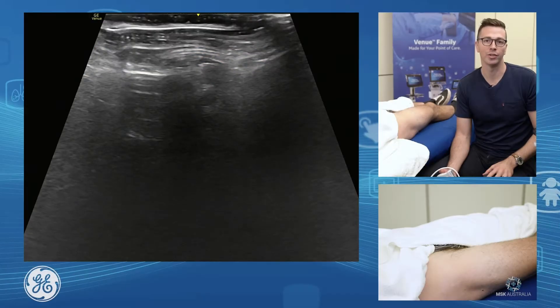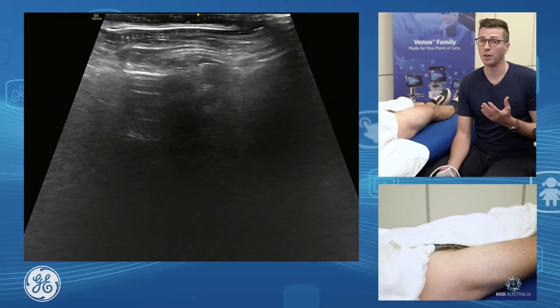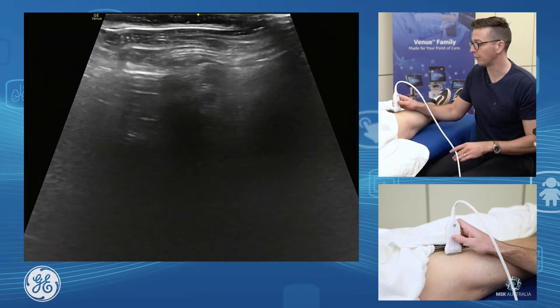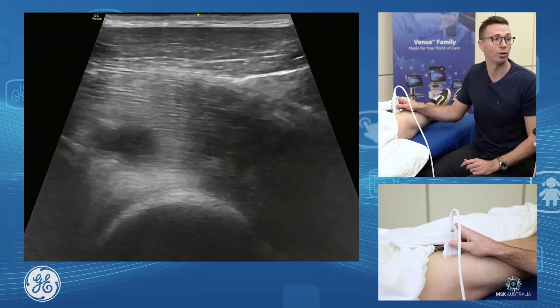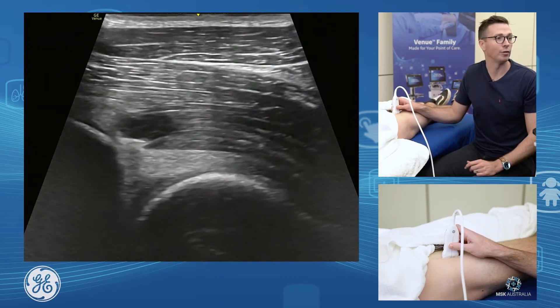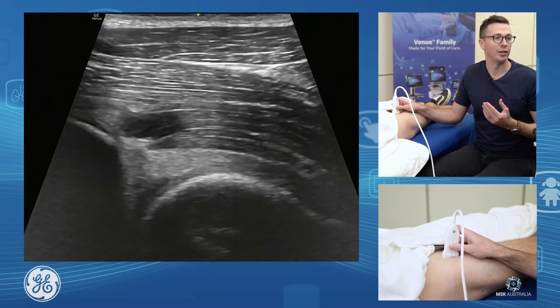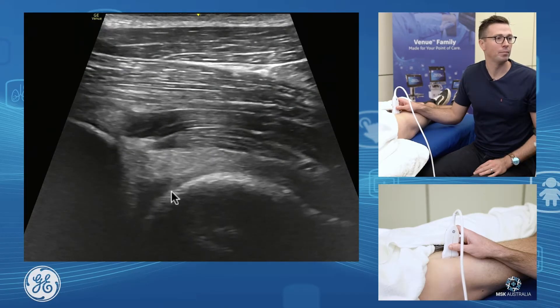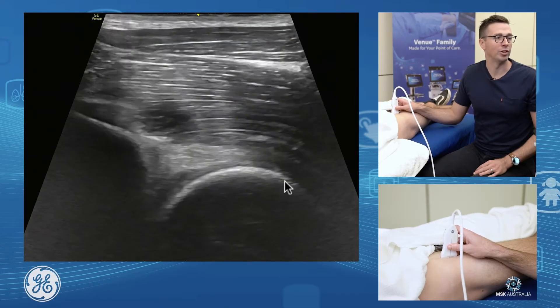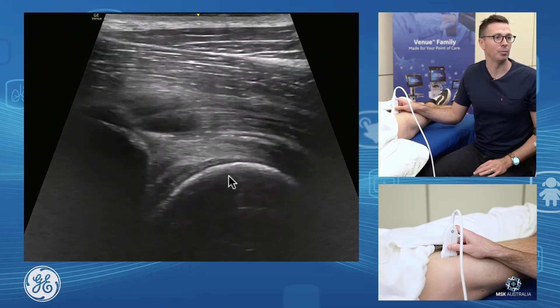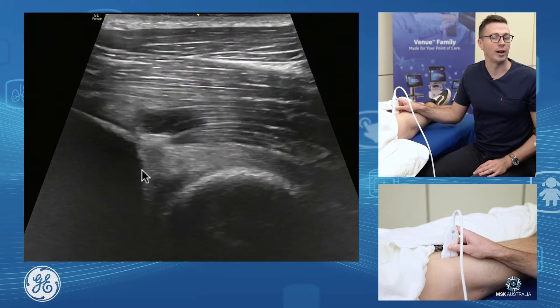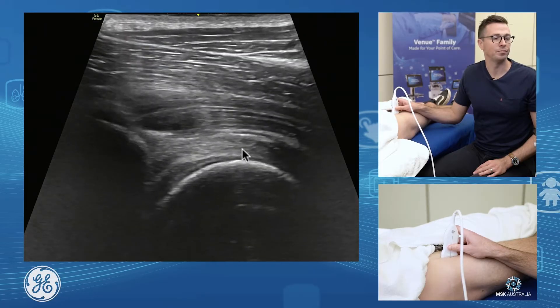Anterior Hip Joint Assessment. First of all, what we're going to do is assess the hip joint proper itself. We'll find the anterior hip, put our probe straight on the front and have a look. We'll identify our femoral head, we'll identify the anterior aspect of our acetabulum, and we'll see the front triangular shape of the anterior labrum.